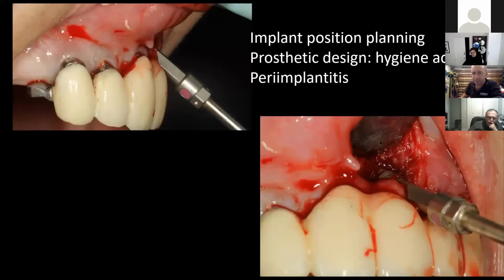So look at the position of the implant placed. I mean, I don't understand. I don't understand how these things work. It just makes me very, very irate watching this case, and I have to remove this. You go to the angulation of the implant. Was there planning? Not really.